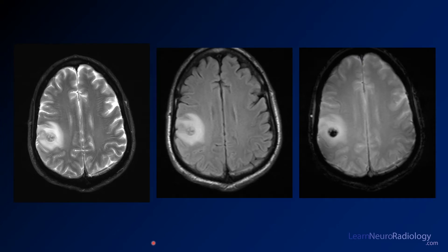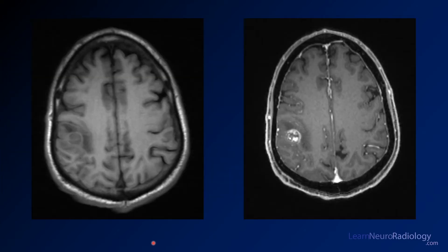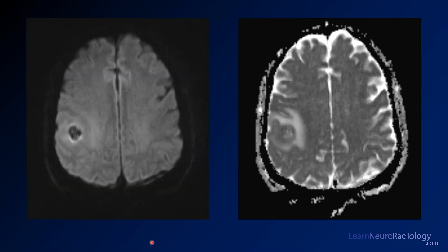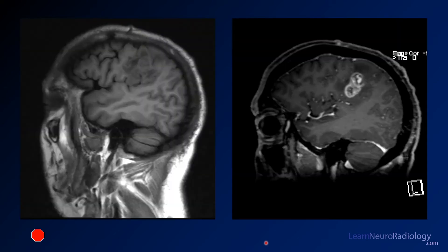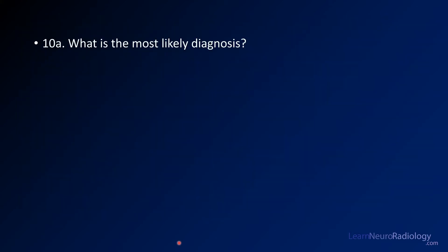Here you see some images from an MR of the brain. These are pre and post contrast images through the same region. Here are your diffusion images through the same area — this is DWI, and this is ADC. Here you see sagittal pre and post contrast images through that same lesion, with the abnormality visible. These are the last images.